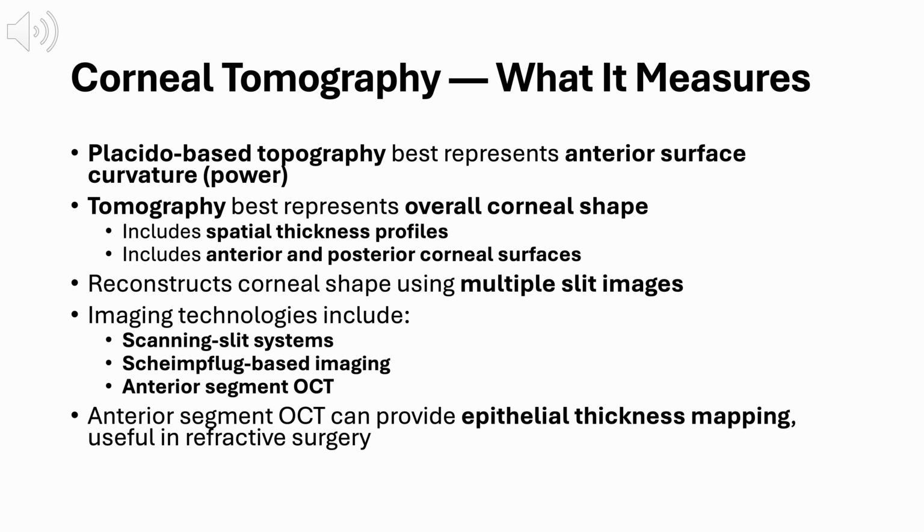Up to this point, we've been talking about corneal topography, which really focuses on the front surface of the cornea and tells us about anterior curvature and power. That's extremely useful, but it's also only part of the story. This slide is where we make the shift from topography to tomography.